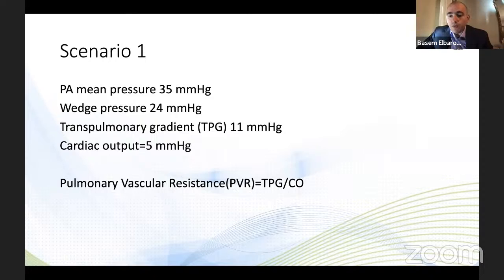And I wouldn't take a right ventricular pressure. I would just go quickly across the right ventricle, hope not to cause a PVC, and have the transcutaneous pads on. And on the way back, I wouldn't measure the right ventricular pressure either. I just come back straight to the right atrium, because the right ventricle is where the ectopics might happen from the catheter tip and trigger a complete heart block.